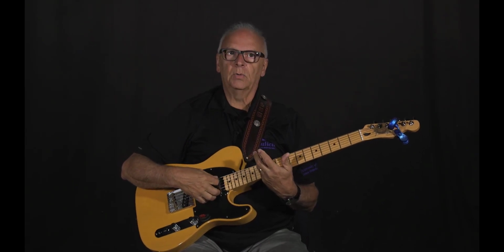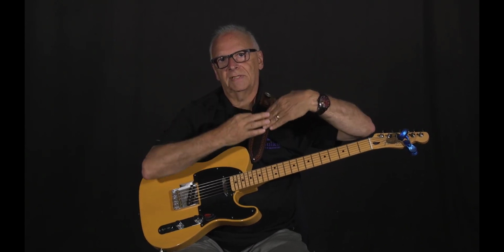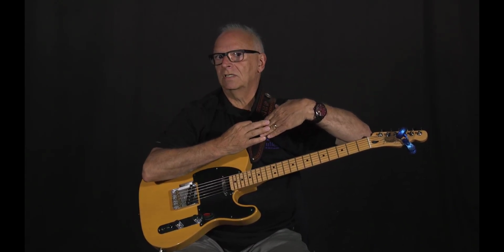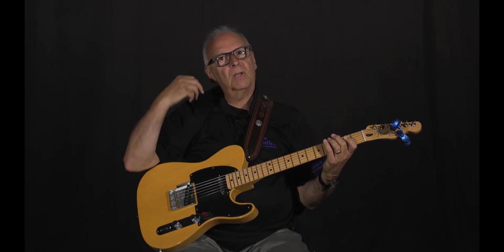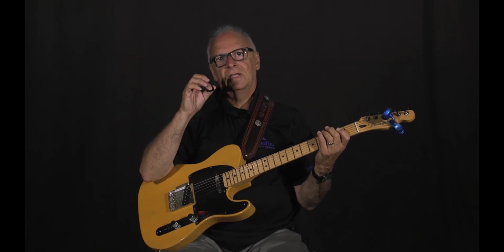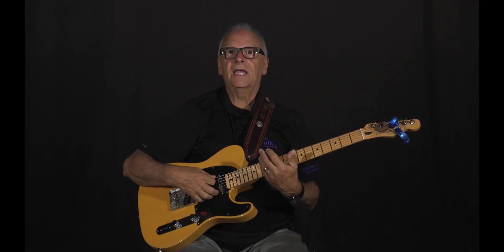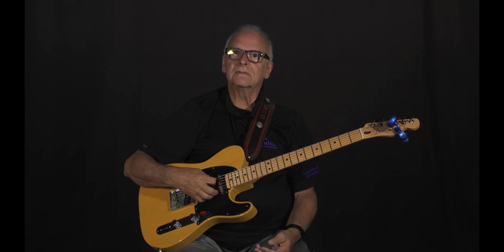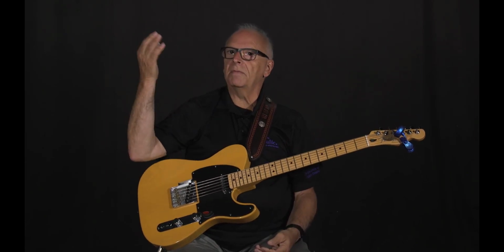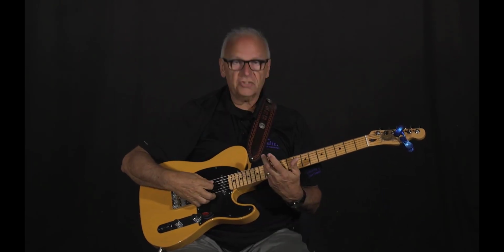If I do that, I will suppress the first harmonic, which is the one that's bouncing up and down this way. So that one will be blocked. But the secondary one that goes through that point will not be blocked, and you will hear it. So let me give you the fundamental one, and now I'll block it, and you'll hear the harmonic, hopefully. So that one is double the pitch of the first one. It's an octave apart, but you definitely hear it, and you can do that with all the other strings.